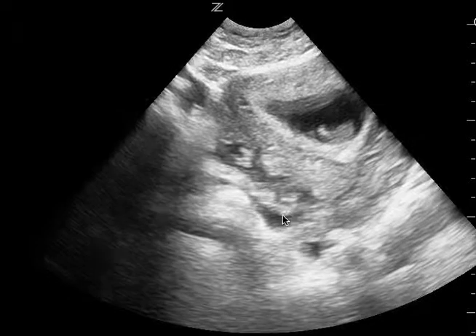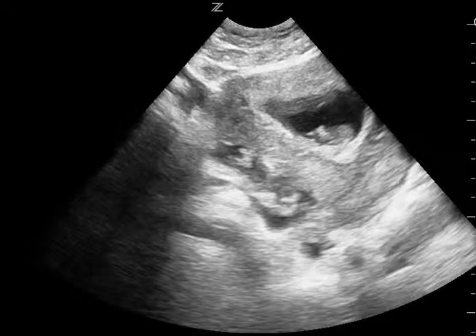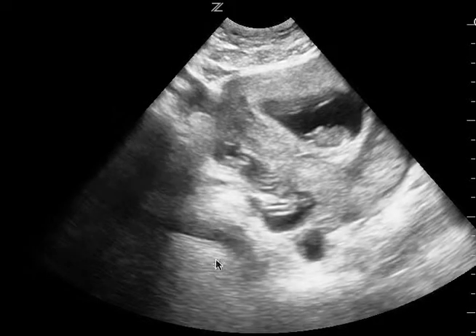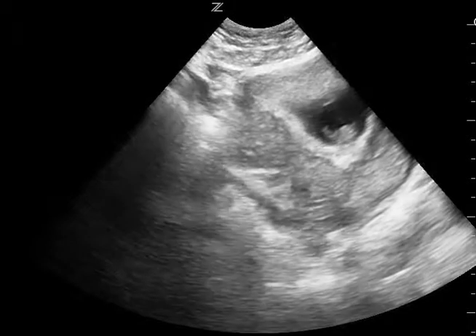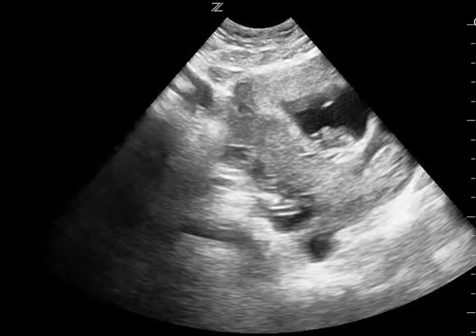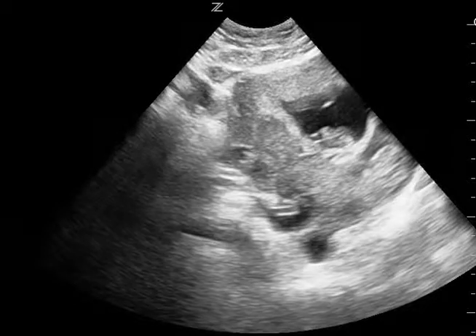Similarly here, I'm having trouble telling if this is free fluid or not, but it is concerning enough to me where I would call this as a positive study for free fluid. Now, patients who are pregnant can have free fluid — it could be physiologic, but it also could be pathologic in the setting of trauma. So something to keep aware of.